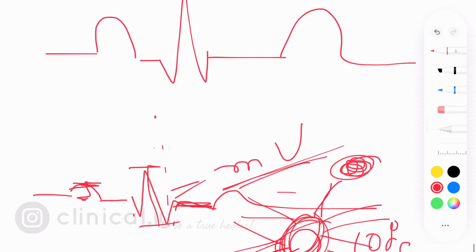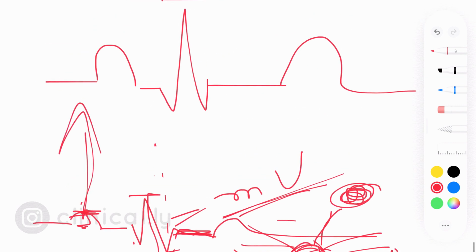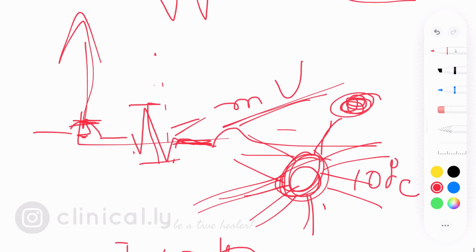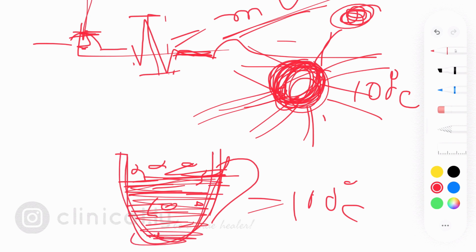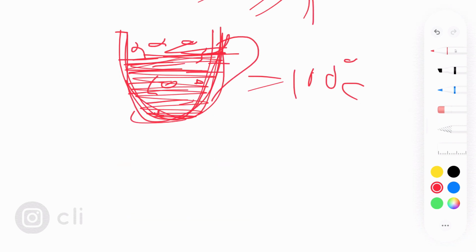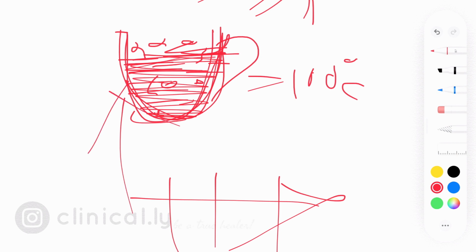So this is the exact same thing which happens at the y-axis. It is not the recording of the actual voltages happening in the heart, but these are the voltages reaching the recording electrode which are placed on the skin of the patient. It is important to know about the x-axis values being absolute timings and the y-axis values being perceived relative values.